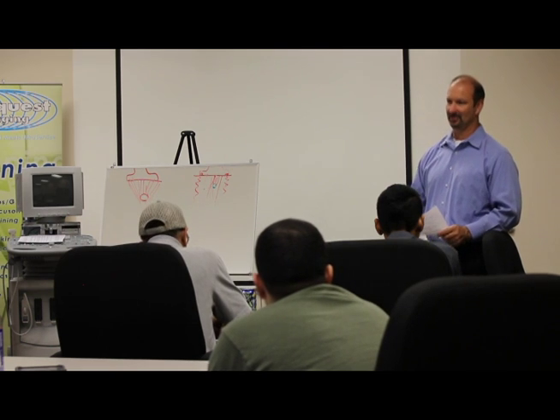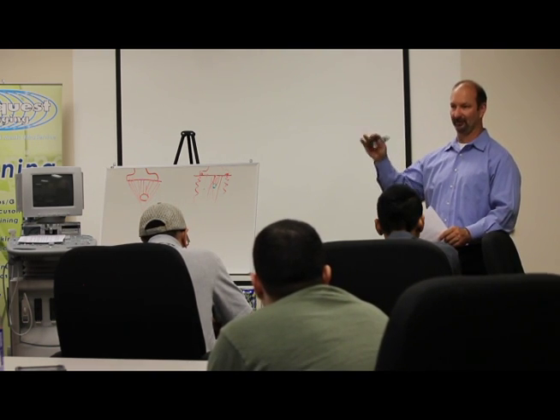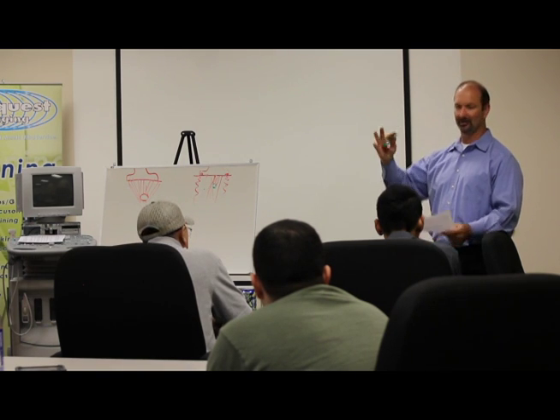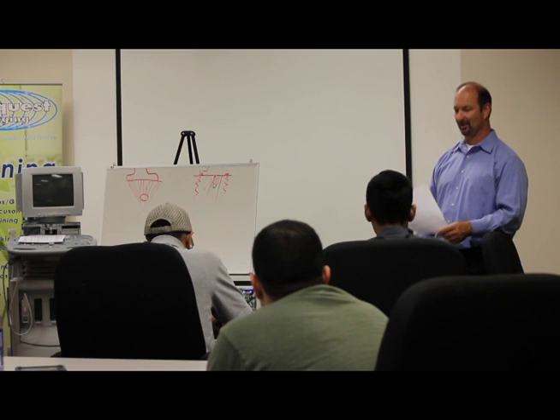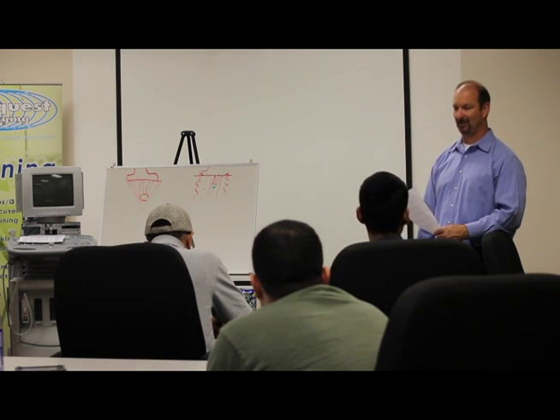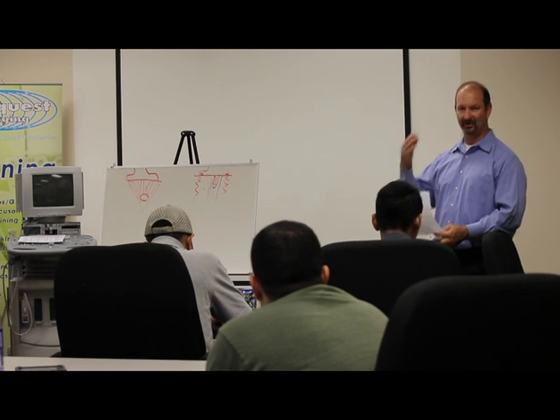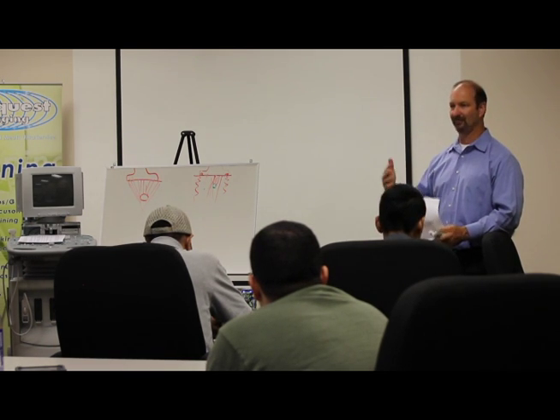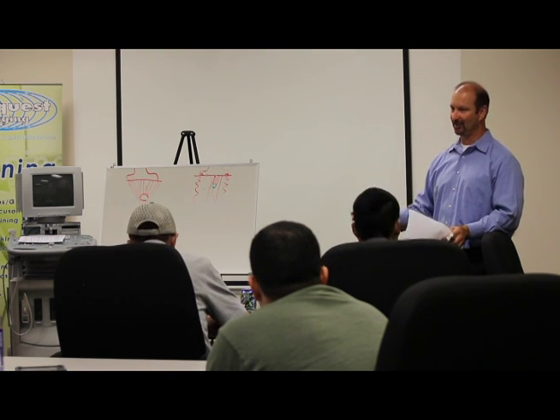And there's an equation for the energy that's lost for every centimeter depending on the frequency. Those are what the physics guys are all about. So as you're talking to customers, what are you going to use your machine for? Vascular access. You're going to be looking at veins. Great. Veins near the surface, higher frequency.